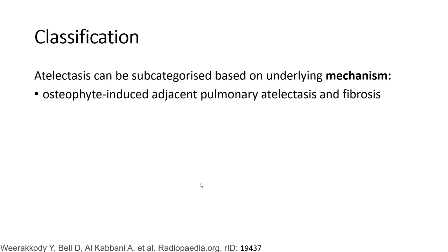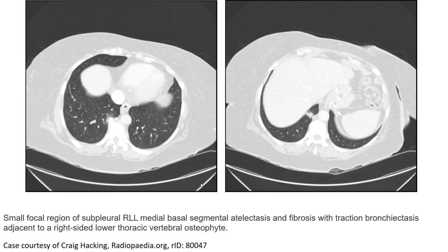This is an example of atelectasis where CT showed a small focal region of subpleural right lower lobe basal segment atelectasis and fibrosis, with traction bronchiectasis, adjacent to a right-sided lower thoracic vertebral osteophyte.